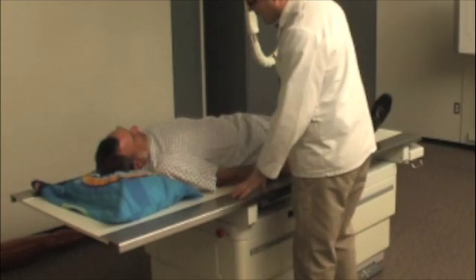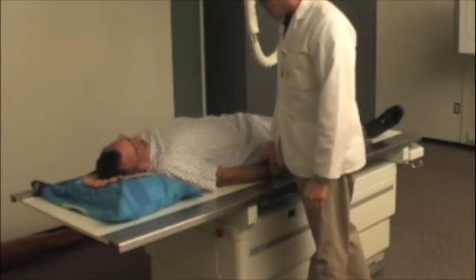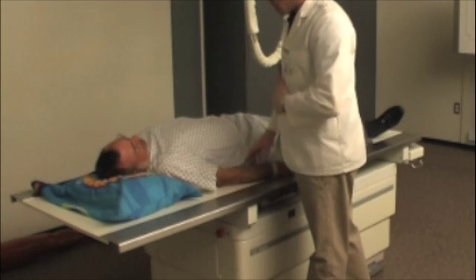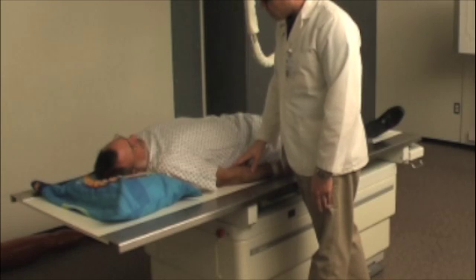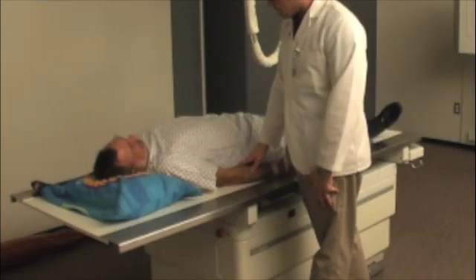All right, Mr. Smith, you doing okay with that hard table? Yeah, I'm doing okay. Don't be too much longer here. We're going to do another picture of your shoulder, and this one's going to involve you bringing your arm out away from your body a little bit. I know it's going to be a little bit painful for you, but I'll get everything set up first and try to make it as quick as possible. I can't promise it's going to be pain-free, but I can promise it'll move as quickly as I can.